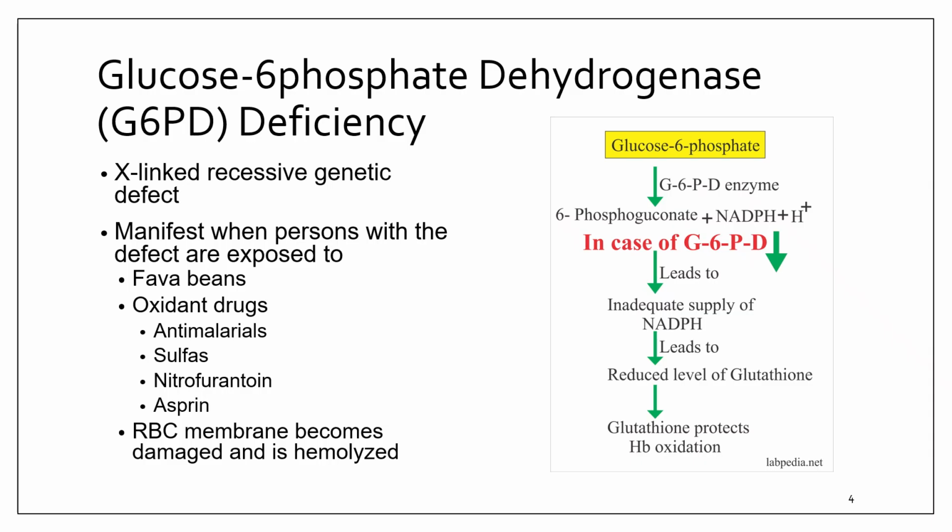As macrophages remove these inclusions, they literally bite chunks out of the red blood cell membrane. This produces bite cells and blister cells. These are classic peripheral smear findings in G6PD deficiency. On the smear, you may see bite cells, which have irregular membrane defects, blister cells, which have a vacuole-like appearance, polychromasia from reticulocytosis, and evidence of hemolysis during acute episodes.